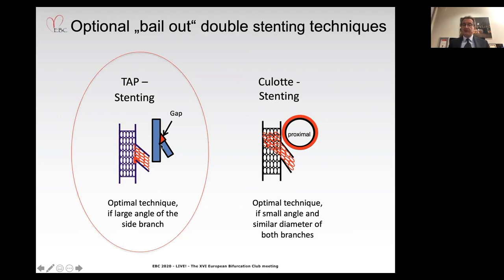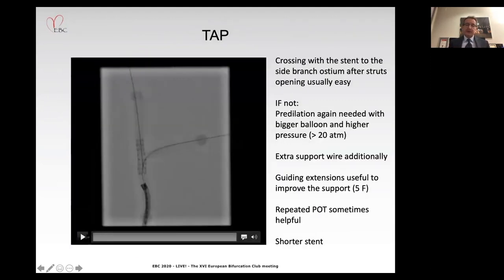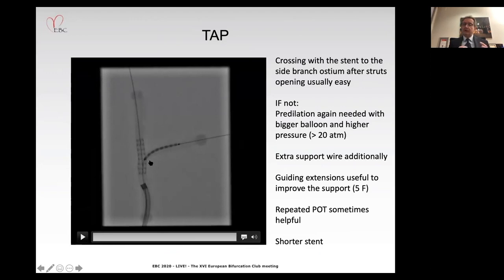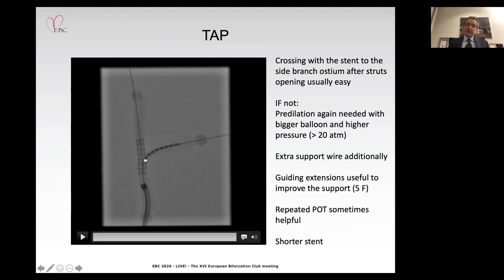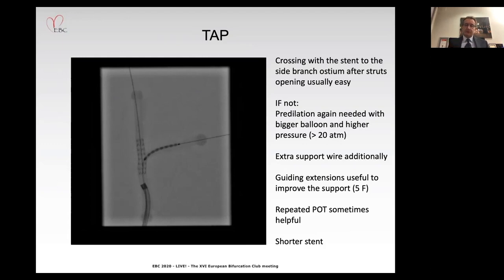There is a risk of achieving a gap in the side branch ostium, or having too large a protrusion with a long metal neocarina. If we proceed with side branch stenting after predilatation and kissing balloon maneuver — in cases of side branch dissection, TIMI flow below 2, or residual stenosis more than 75% — the next step is to place the stent. We must ensure complete coverage of the side branch ostium, including both the distal and proximal carina, which means we typically create a small distal protrusion.